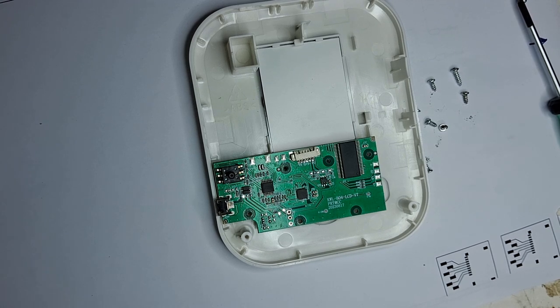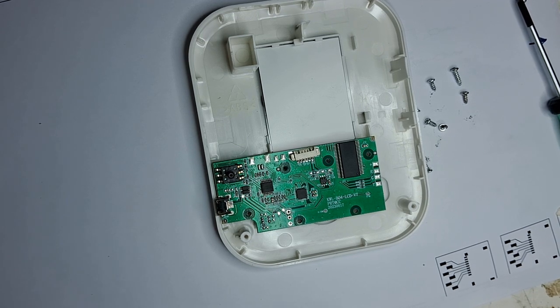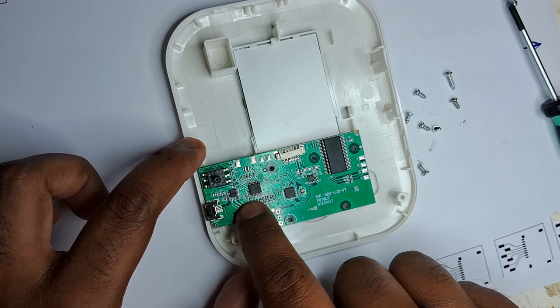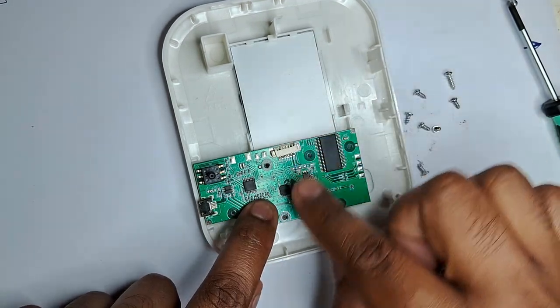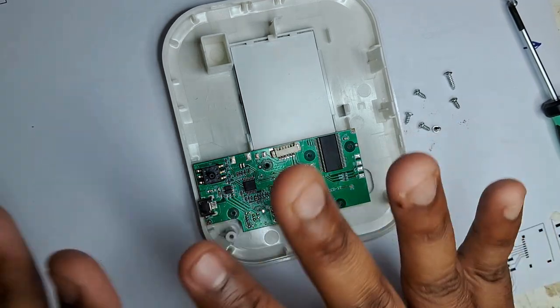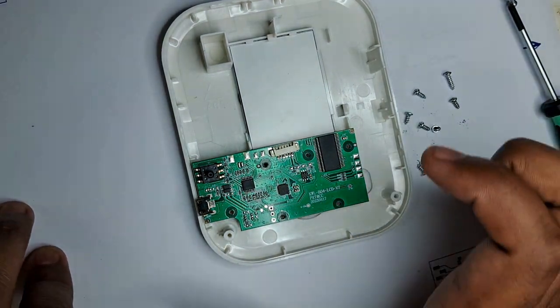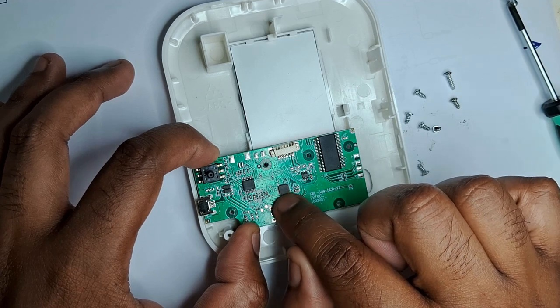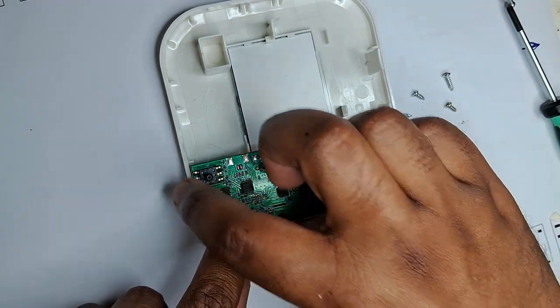Now after discussing the pump, the valve, and how they are interfaced with our main blood pressure cuff, we are going to dive into this circuit, which is the motherboard, and it is responsible for interfacing this pressure sensor, typically, and this LCD and everything together to calculate the blood pressure using the oscillometric method. Okay, so now in this PCB, this is the main microcontroller. It means it's the heart of the whole system, and without this, nothing can happen.